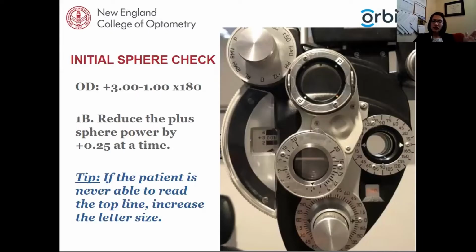As I'm changing the sphere power, I'm making sure to prompt the patient and say, let me know as soon as you can see that top line. If they're never able to read the top line, it could be that maybe you won't be able to correct the patient to read the bottom of the chart. In that case, you just may need to increase the letter size. They could also be having trouble reading the chart if your retinoscopy findings are a little bit off, or if there's a high amount of cylinder and maybe the axis is off a little bit. So there are a few variables that could impact whether or not they're able to read the chart at this step. If they're having difficulty, you can always just increase the letter size.